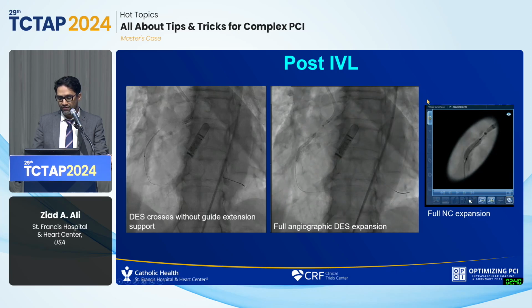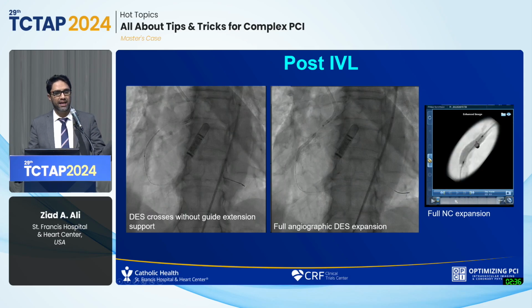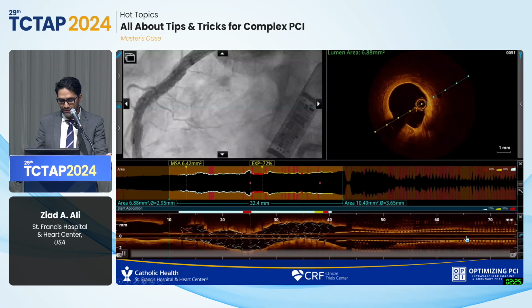And for all of you who have these, as Professor Hahn showed very nicely, all heavy calcification should be using advanced fluoroscopy, especially if you're using IVL. So make device detections, clear stent boost a part of your program, and I'll make a comment on Dr. Hahn's case perhaps at the end of this.